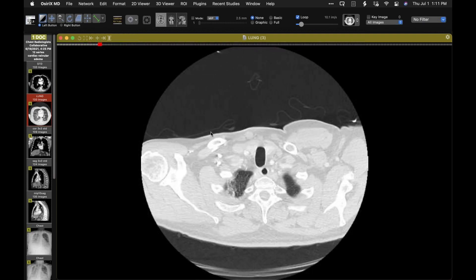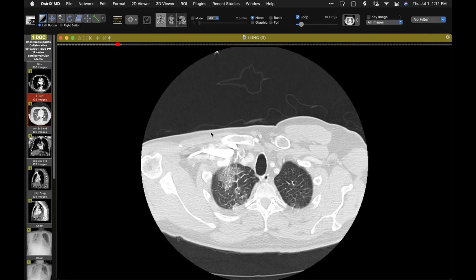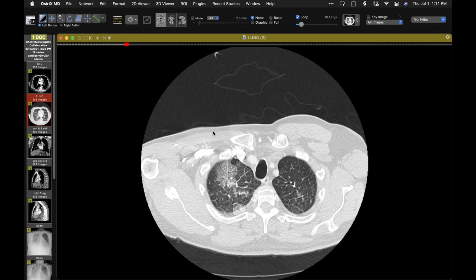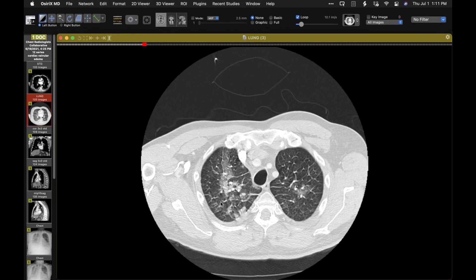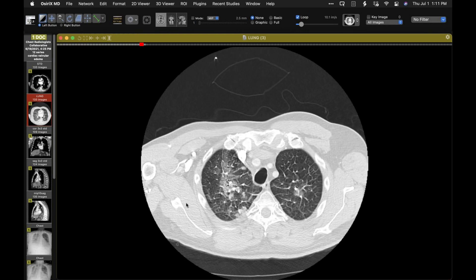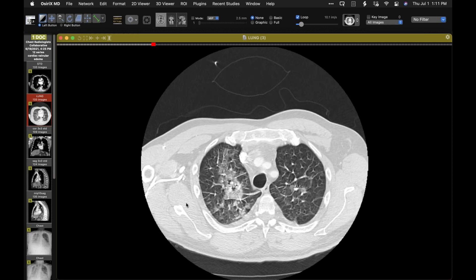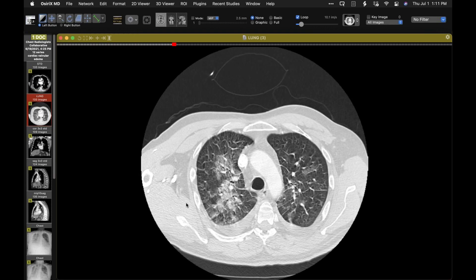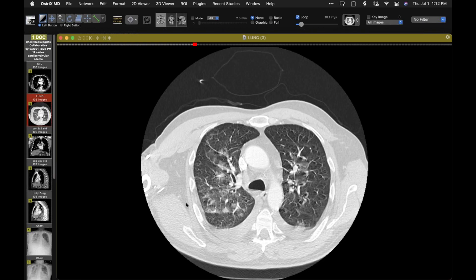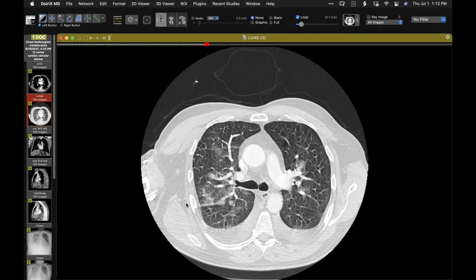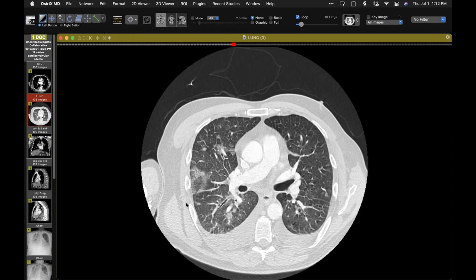Starting up here, there's a very nice demonstration of the septal lines of interstitial lung edema — florid. But then we also have ground glass attenuating opacity in the right upper lobe consistent with alveolar edema. It's clearly again asymmetric — there's a lot more ground glass opacity of alveolar edema in the right upper lobe. Right upper lobe, right central lung, definitely asymmetric edema and particularly so in the right upper lobe.